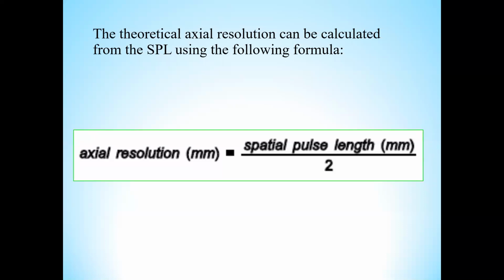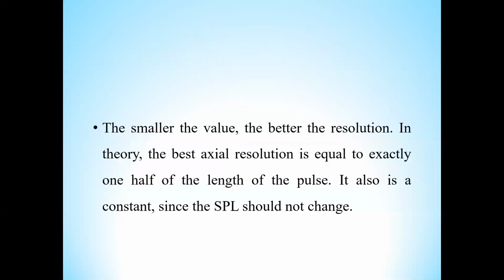Just for example, if we have an SPL of 1 mm, then the axial resolution for that frequency will be 0.5 mm.